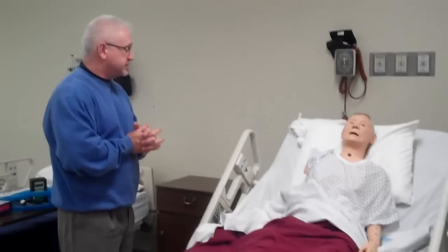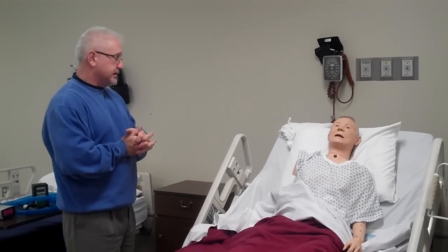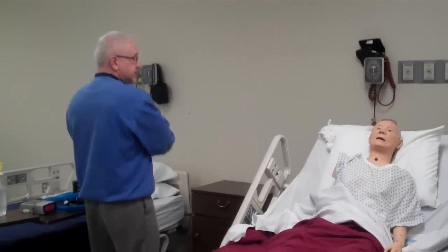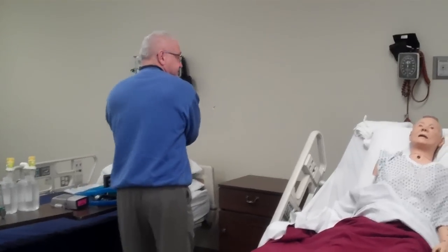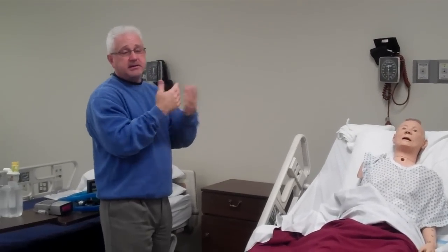All of this would be in a bag — not on the table — kept aseptic, as clean as possible. After I've gathered all my equipment, I would proceed to the patient's room and begin like this: 'Hello, my name is Alan. I'm from respiratory care. I'm here to put you on some oxygen. The doctor thought it might help you breathe a little bit better.' At that point, I'd go wash my hands using the alcohol-based rub and let it air dry.